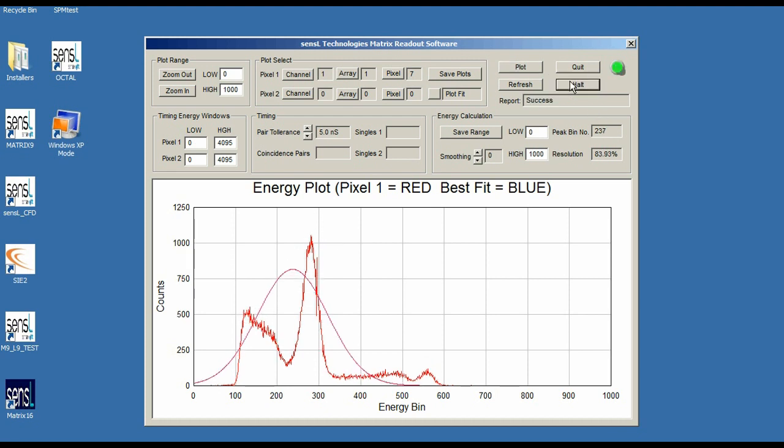I'm going to halt the measurement. What I want to do to actually let the software achieve a good peak fit is I want to select a value that represents the separation between the Compton Continuum and the 511 keV peak. In this case, that point down there looks to be about 225.